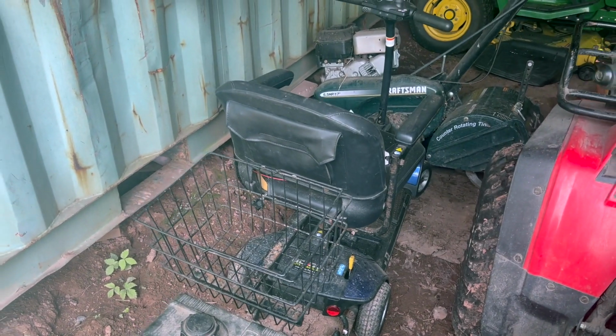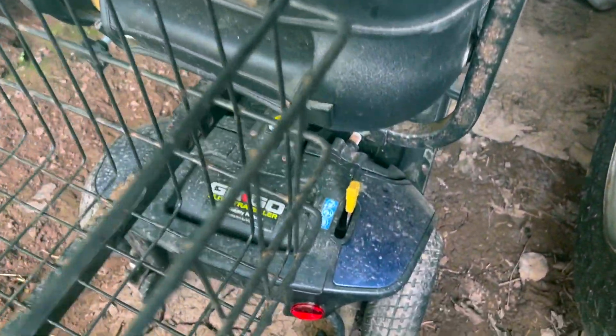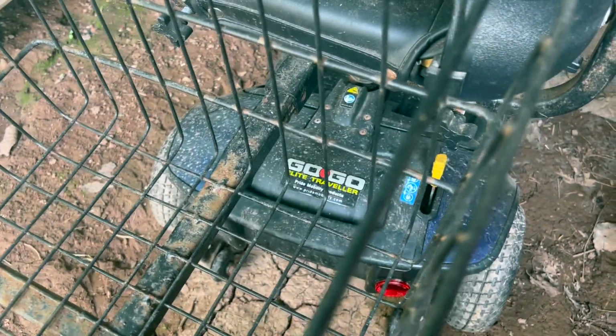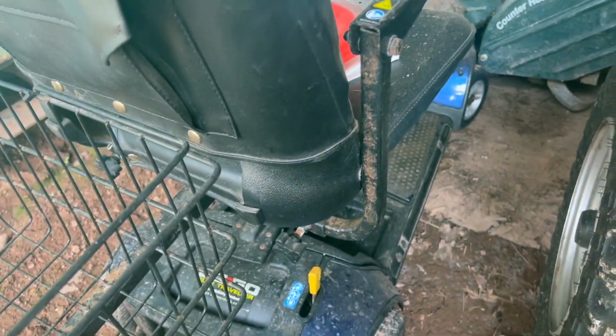My name is Aaron and I like to fix stuff. Today we're going to be working on this GoGo Elite Traveler Pride Mobility Products electric wheelchair.